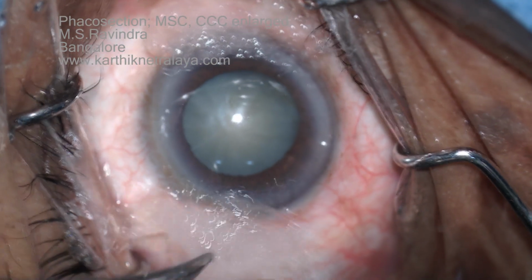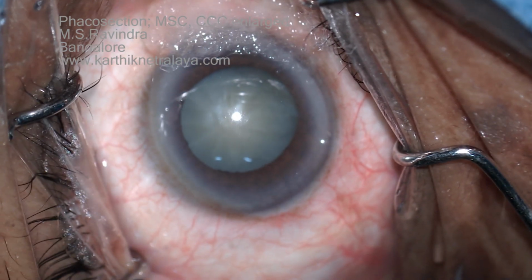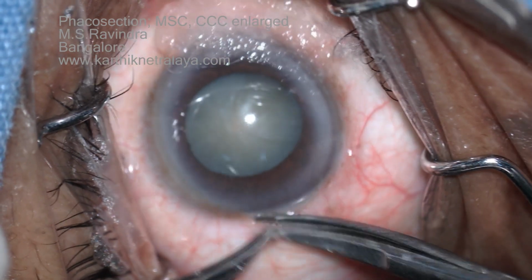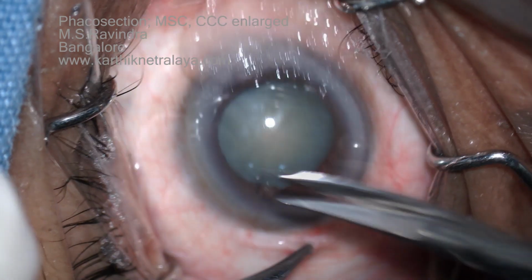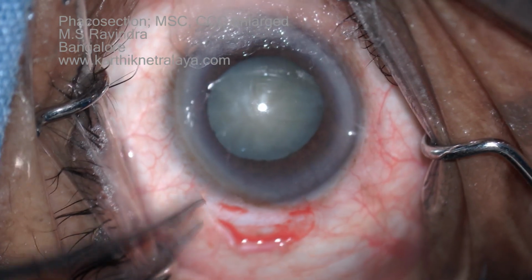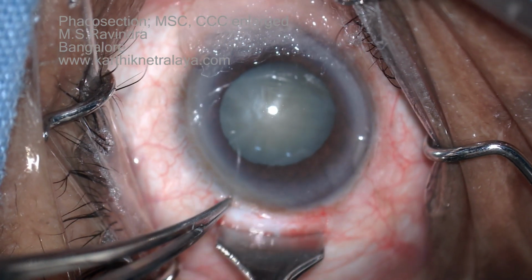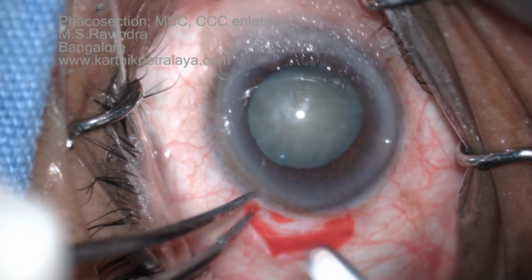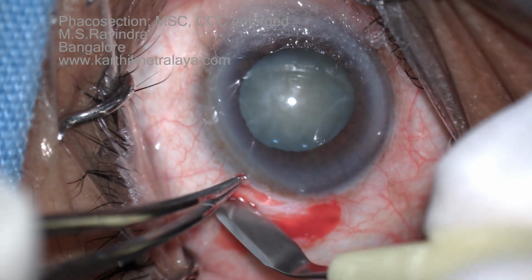A mature cataract with about 8 mm pupillary dilatation. A 6 mm long conjunctival flap is raised with thin horns, without separating them. A 6 mm straight scleral incision is made and hemostasis is achieved.